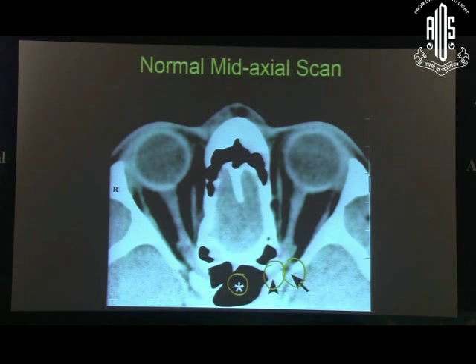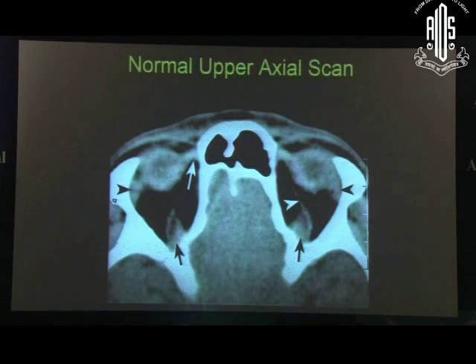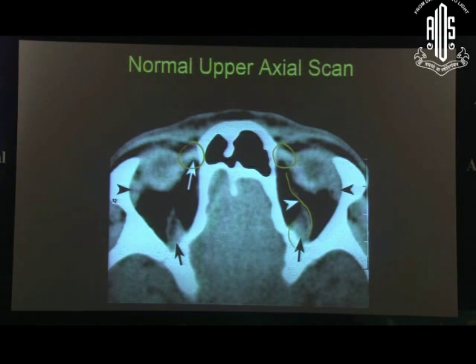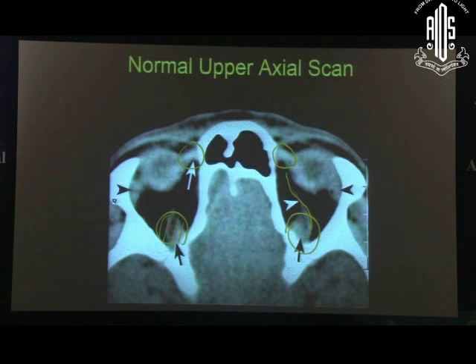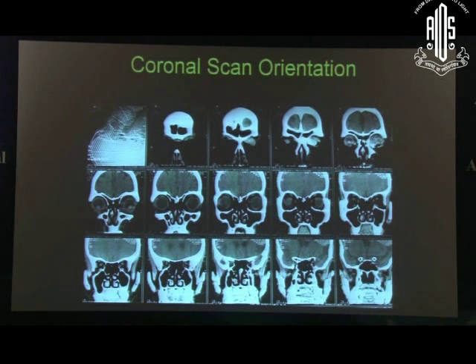You also see the extraocular muscles — the lateral rectus, medial rectus, the trochlea comes into view, and the optic nerve is seen very nicely, as is the eyeball. Further details include the superior oblique, and the structure running like this is the superior ophthalmic vein. Enlarged superior rectus — the superior rectus LPS complex — can sometimes be visualized as an intraconal lesion. And what about this structure? The lacrimal gland. Depending on what you are looking at, you can identify all the normal structures.